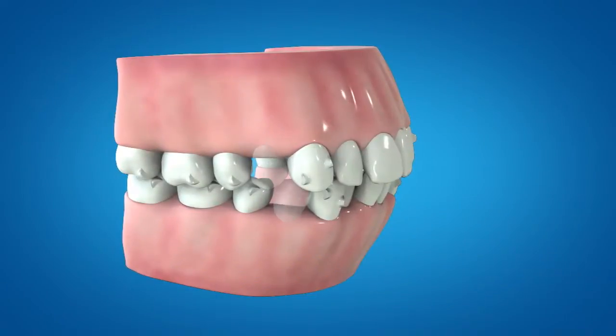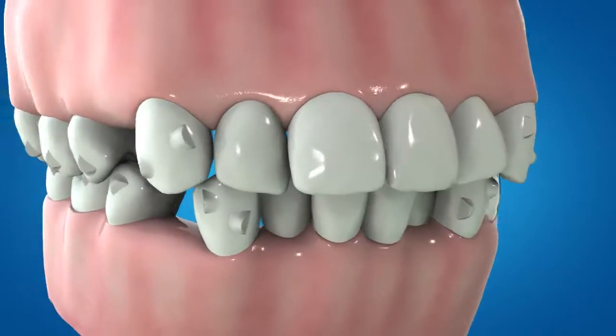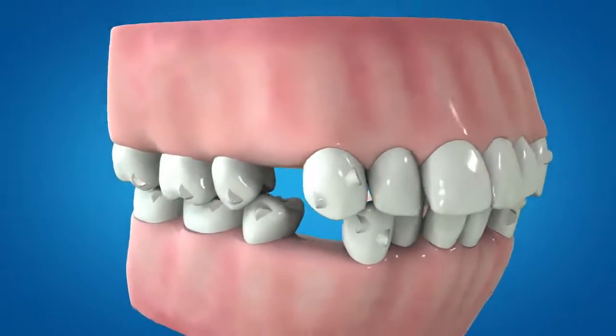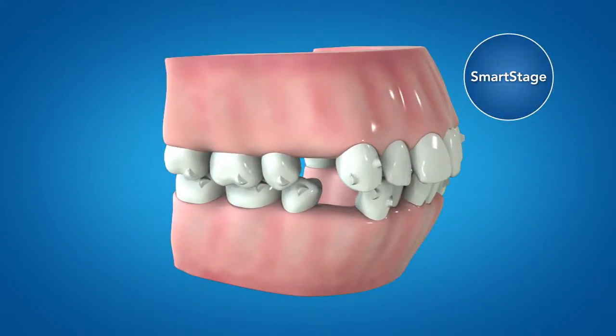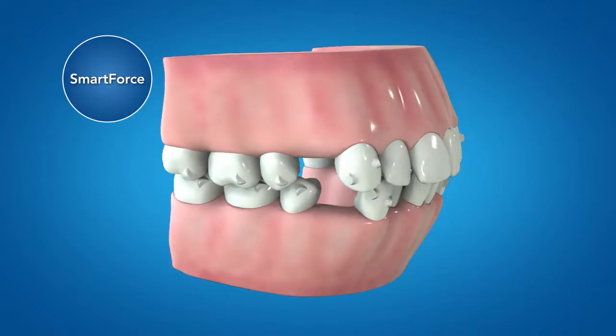The new first premolar extraction solution is designed to provide root parallelism and vertical control, making use of Align's programmed tooth movements called SmartStage, as well as new SmartForce features. The new SmartForce features are designed to deliver the force systems necessary to achieve predictable tooth movements.